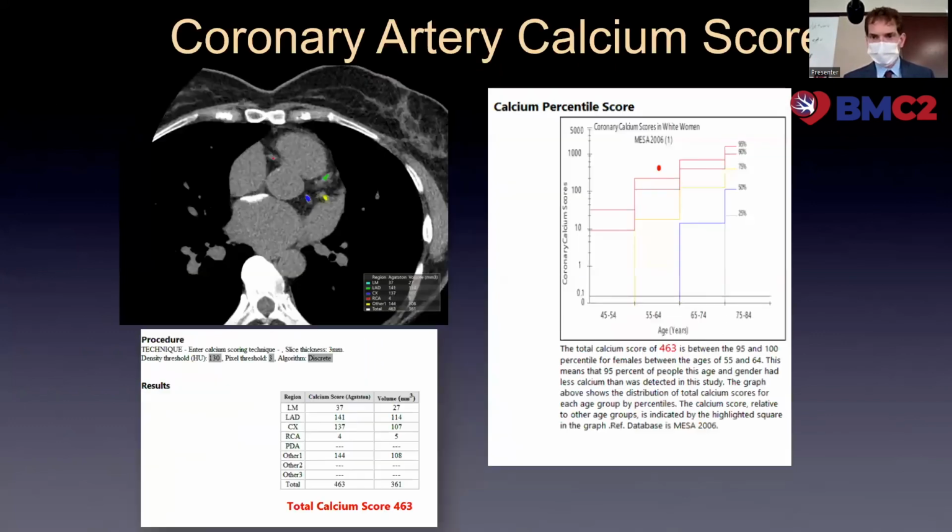I'm going to skip this in the interest of time. I'll just show a couple of slides on calcium scoring.